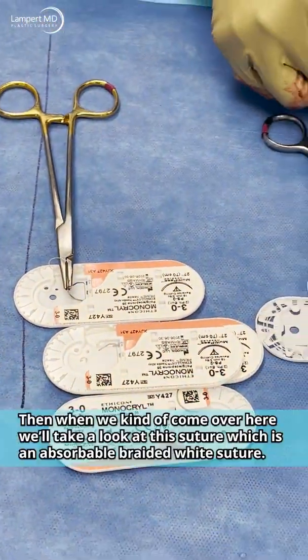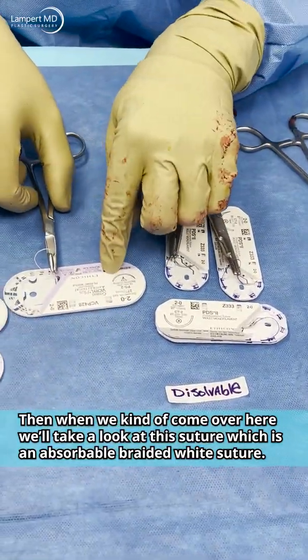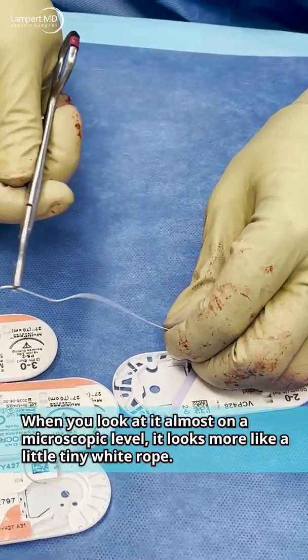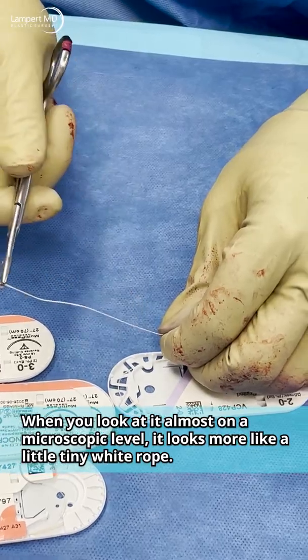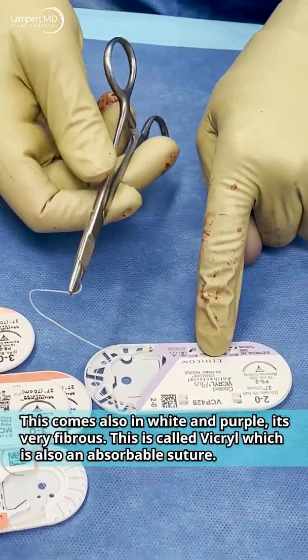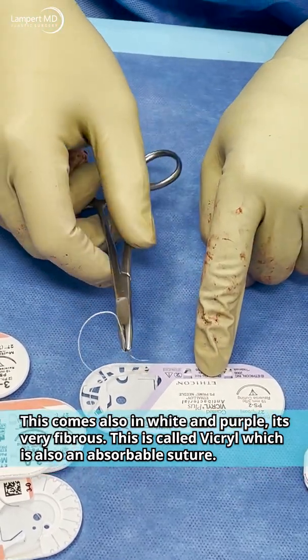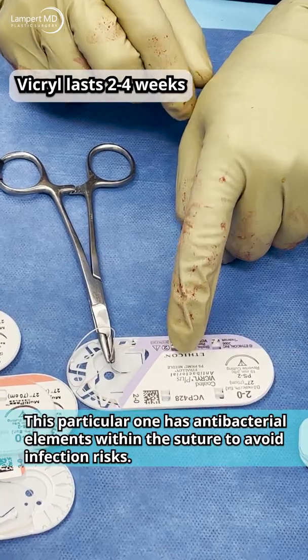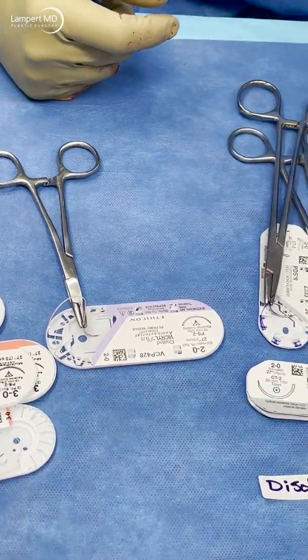This suture is an absorbable braided white suture. When you look at it almost at the microscopic level, it looks more like a tiny white rope. It comes in white and purple and is very fibrous. This is called Vicryl — also an absorbable suture. This particular one has antibacterial elements within the suture to help avoid infection risk.